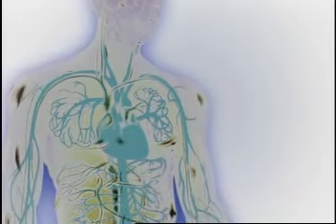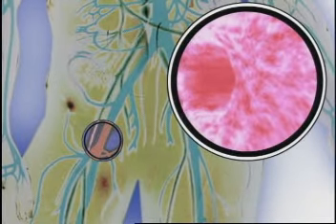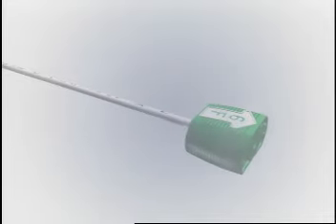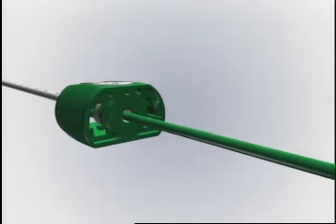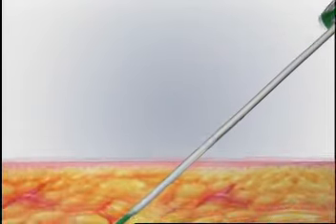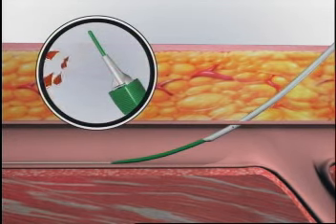A key element of successful device deployment is to first assess the location and characteristics of the puncture site using fluoroscopy. The vessel should be free of disease and greater than 4 millimeters in diameter. Next, snap together the STS Plus modified arteriotomy locator and insertion sheath. The locator locks into the sheath in only one direction. Remove the procedure sheath and slide the locator sheath assembly over the guide wire. Insert the assembly into the artery until pulsatile flow is achieved, indicating the sheath has entered the artery.